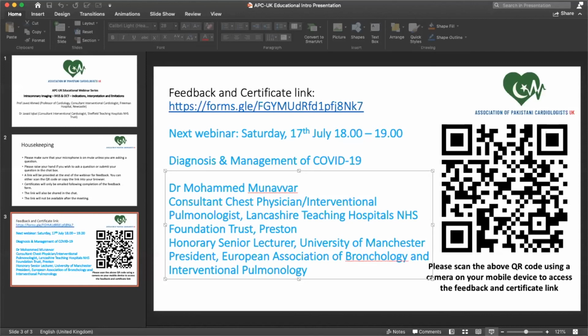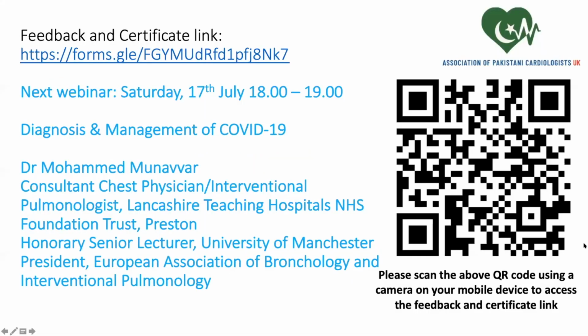I can answer that question. One of the most important things is there was an article in the American College of Cardiology that now there have been about 5 meta-analyses and 3 randomized control trials with drug-eluting stents. I'm not mentioning bare metal stents.